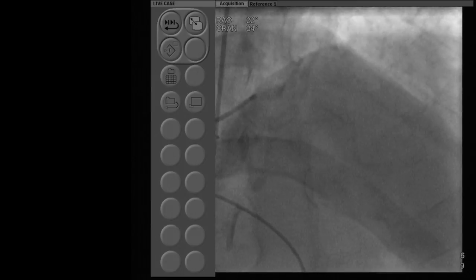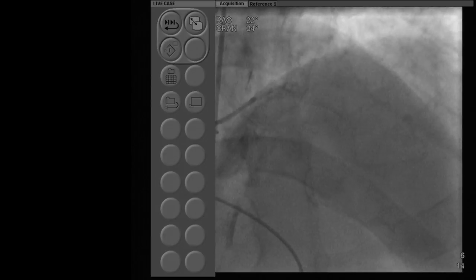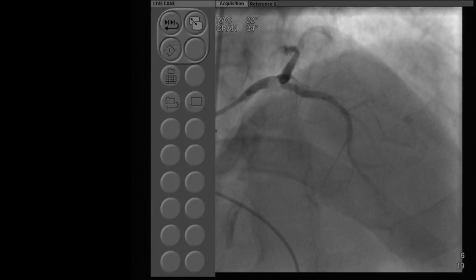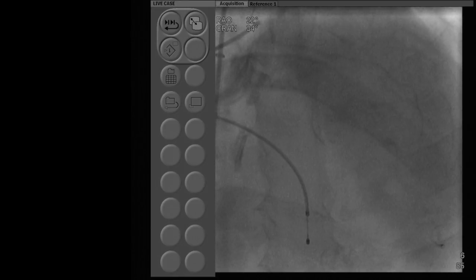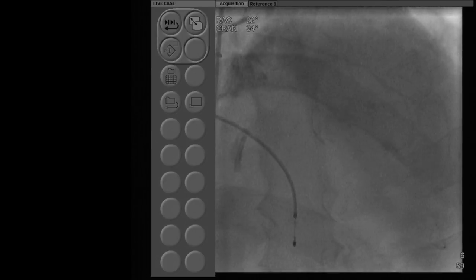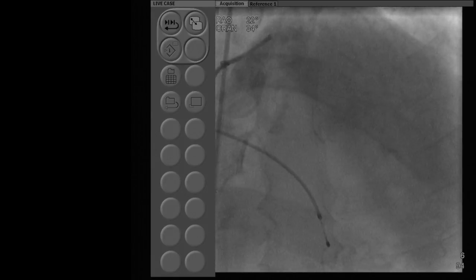One of the pitfalls of OCT is the same. If you have significant disease, more than 95%, and there is no dye clearance, you cannot do OCT, which can give rise to any kind of arrhythmia, especially VFib. So in this case, if you need imaging, we will have to do intravascular ultrasound. Which is okay also, particularly for the left main. Nowadays a lot of data are coming that IVUS adjunct may help to improve overall outcomes, and that is where our plan is today.